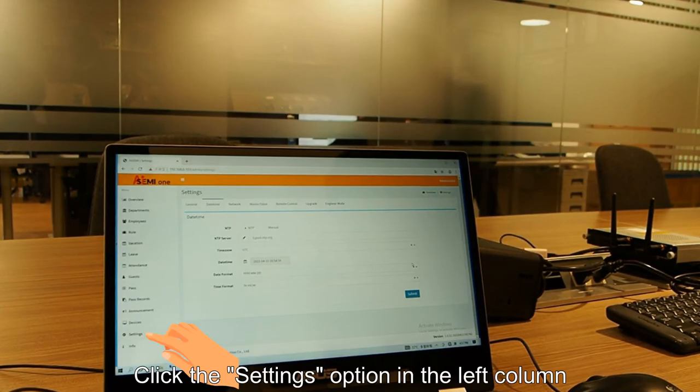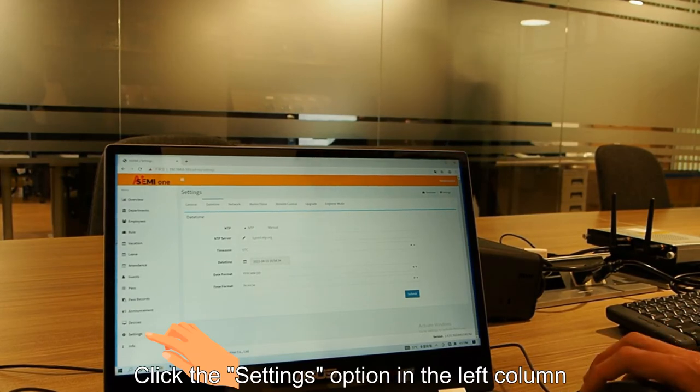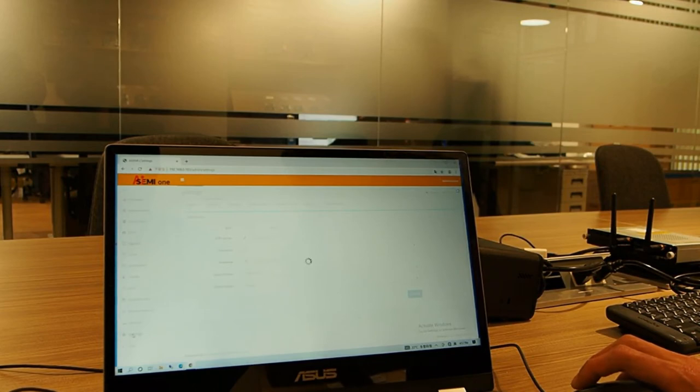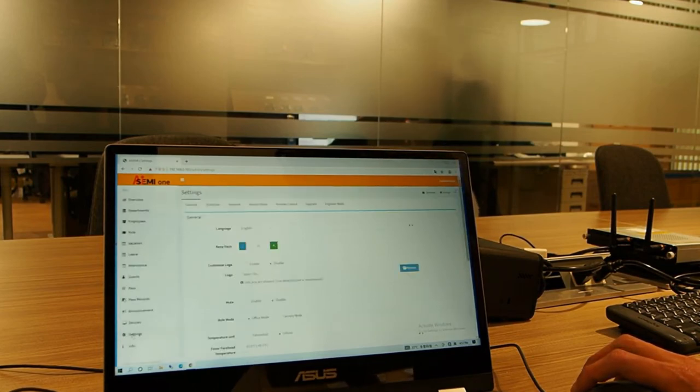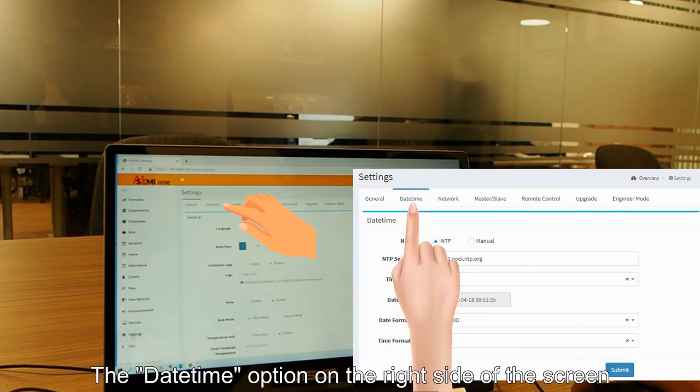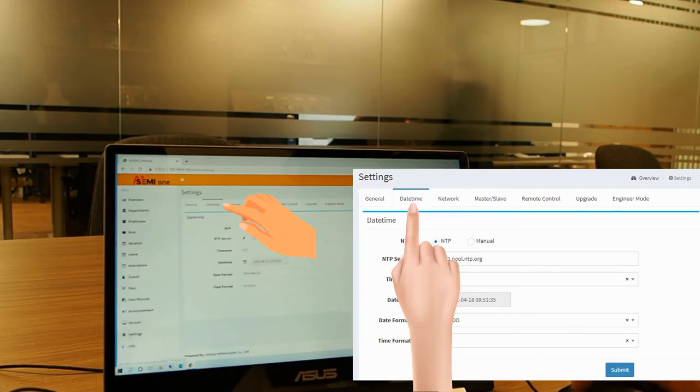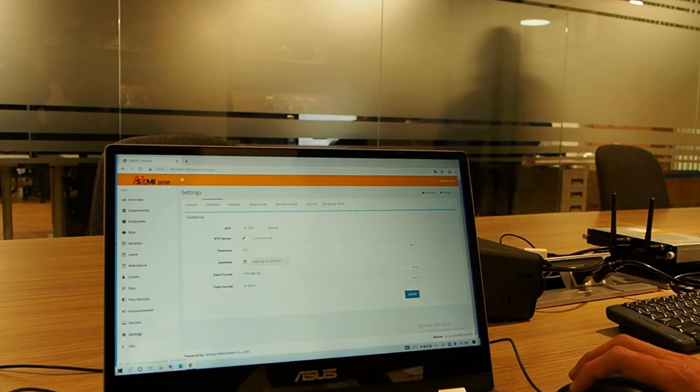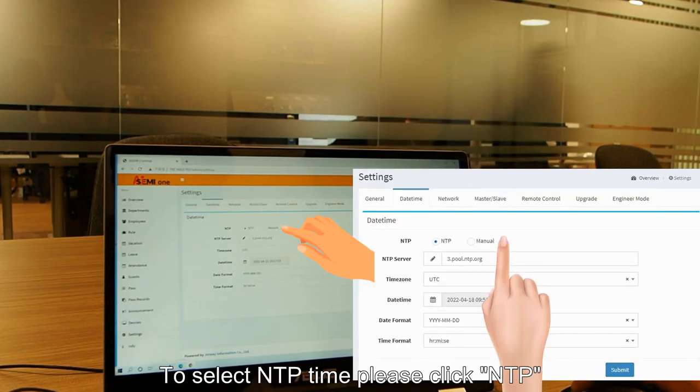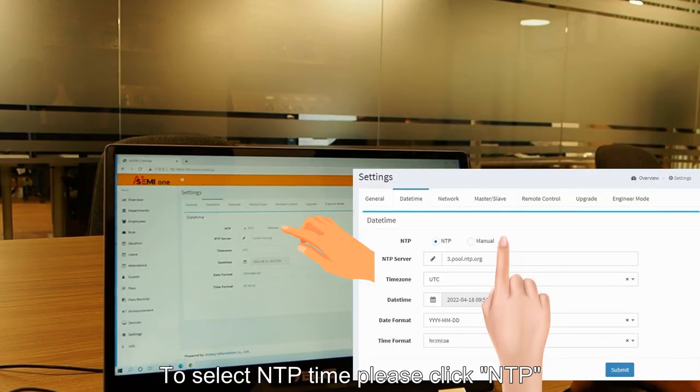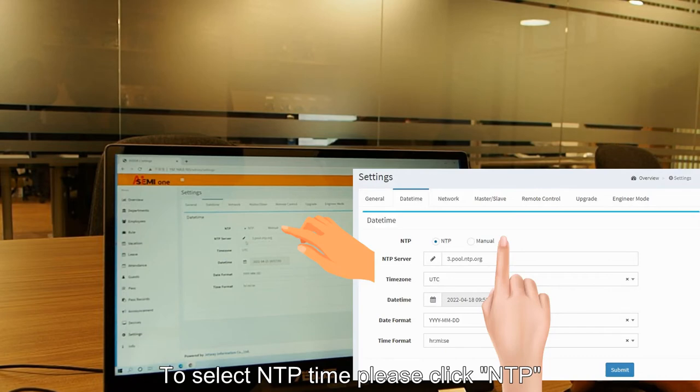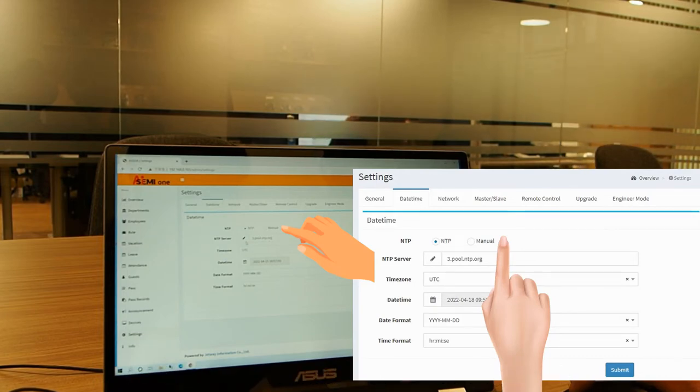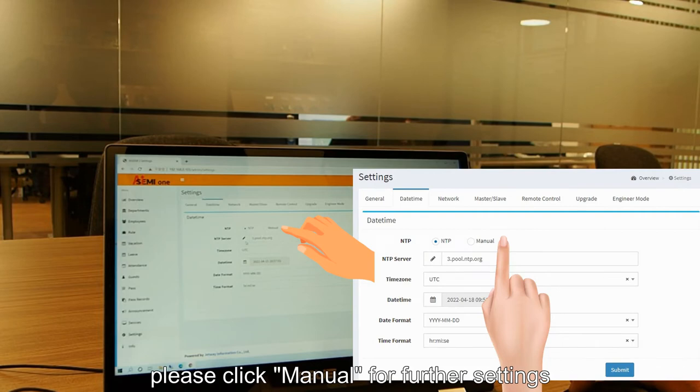Click the settings option in the left column, then the date time option on the right side of the screen. To select NTP time, please click NTP. Or to specify the time and time zone manually, please click manual for further settings.